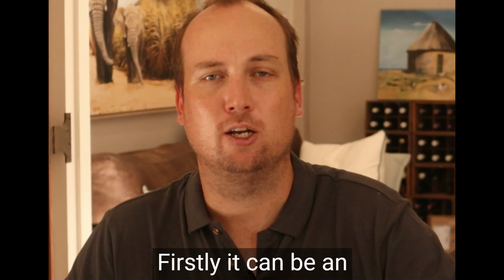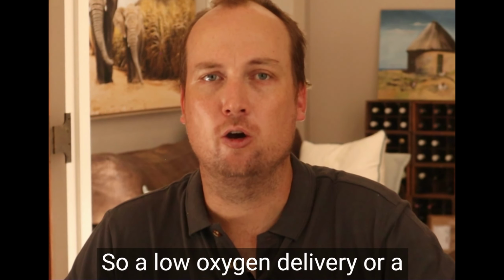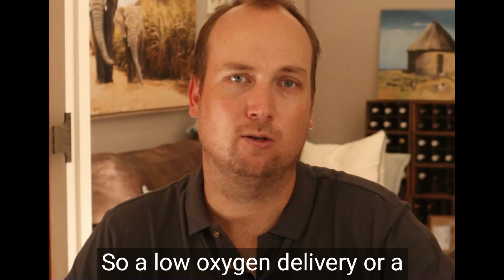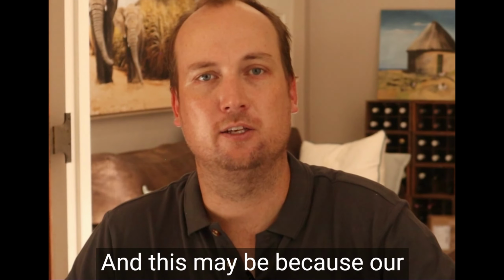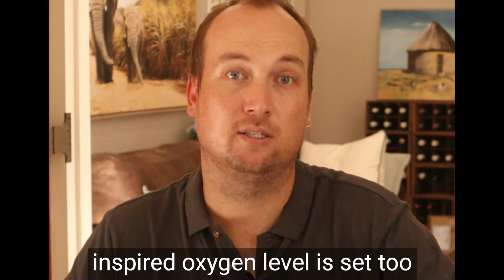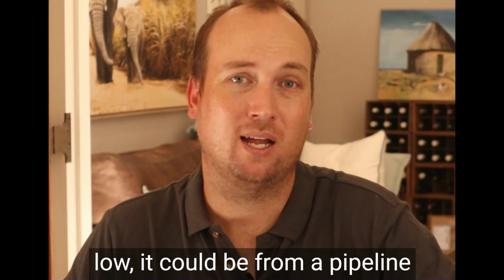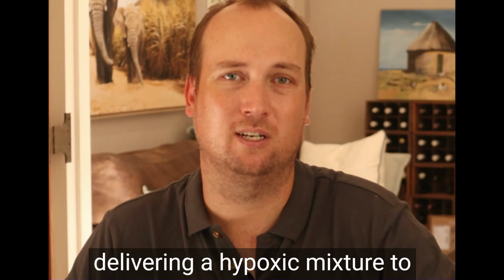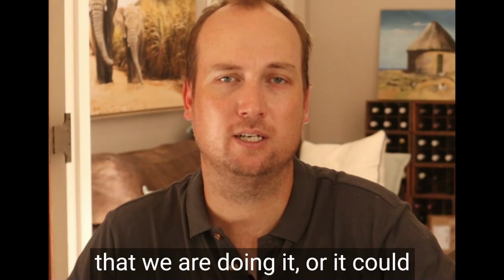Firstly, it can be an oxygen supply issue. So a low oxygen delivery or a low oxygen supply to the alveoli. And this may be because our inspired oxygen level is set too low. It could be from a pipeline oxygen issue where we are delivering a hypoxic mixture to the patient and we don't know that we're doing it.